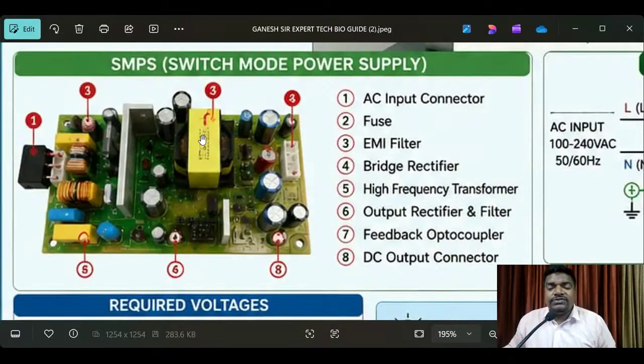We have different types of transformers: high voltage to low, low voltage to high, step up and step down. Step down transformers, and these are very valid pieces of information. I will give live sessions. I will take the proper component and I will explain. With 1000 plus live sessions, and today I want to cover this OT light, I will fulfill all.